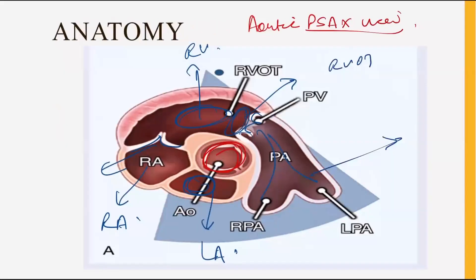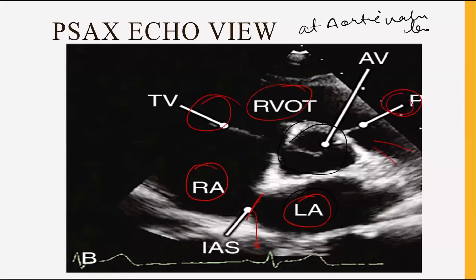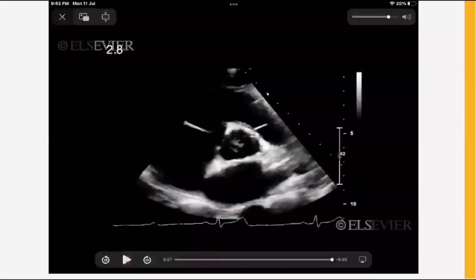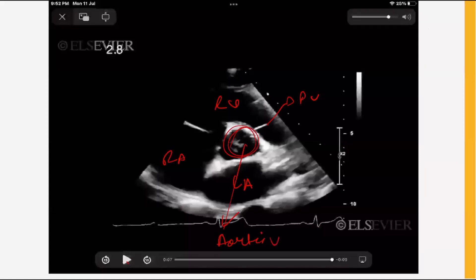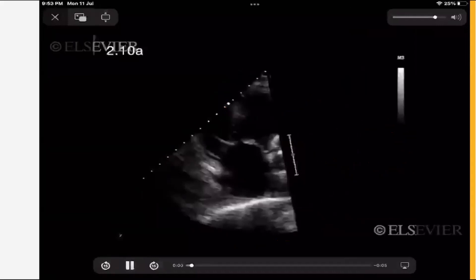In the echo view of PSAX at the aortic valve level, the aortic valve is in the center, and from this view we can determine the morphology of the aortic valve — whether it is bicuspid or tricuspid. We also see the LA, interatrial septum, RA, tricuspid valve, RVOT, pulmonary valve, and pulmonary artery. Pulmonary veins opening into the LA can also be seen.